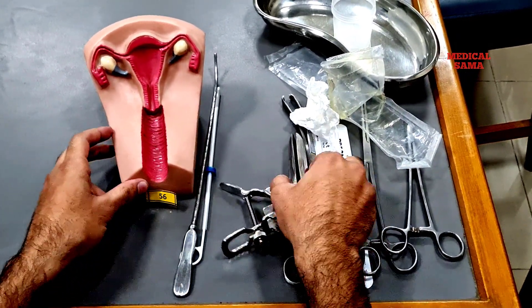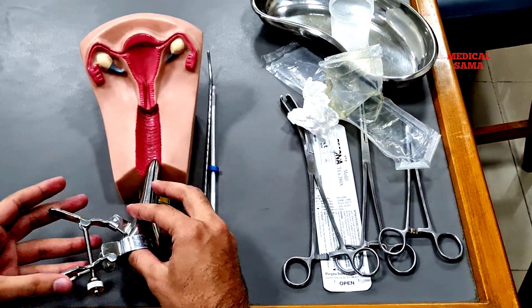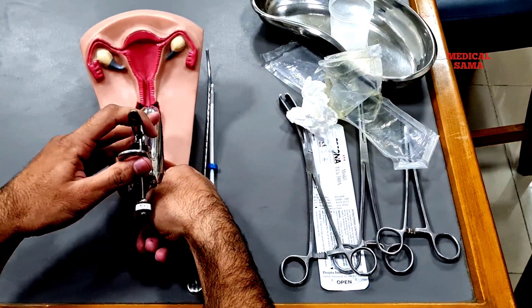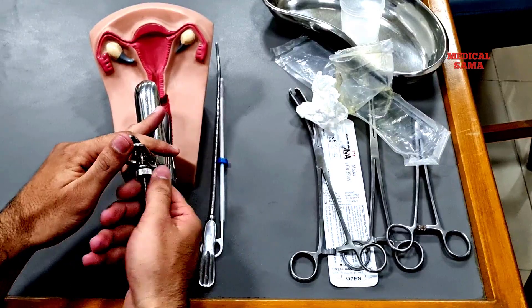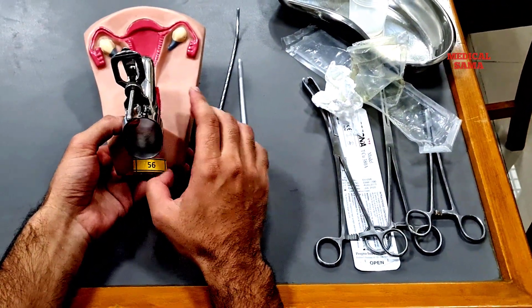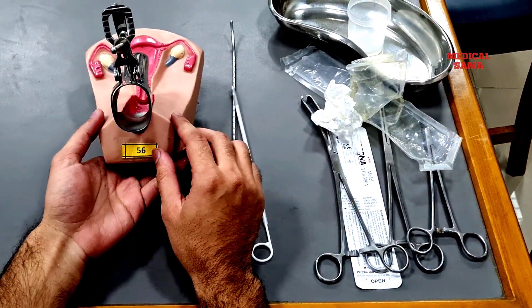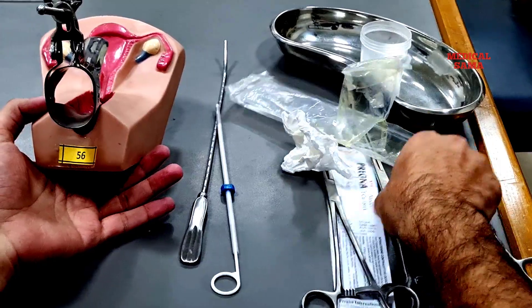Now insert the Cusco's speculum, keeping in mind that insertion should be at 45 degrees, and once you are in, place the Cusco's speculum in horizontal position and open it. Before insertion, you should apply some local anesthesia like lignocaine on the speculum. Now clean the external os of the cervix with the help of a gauze piece.